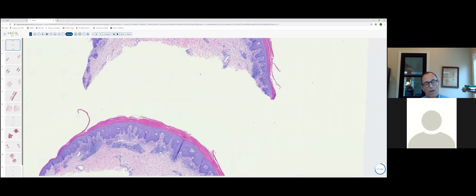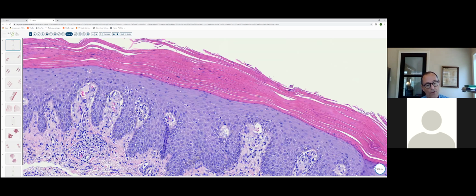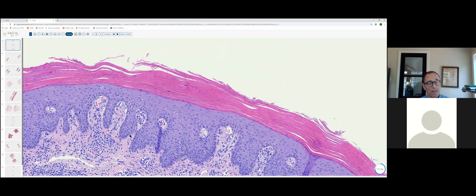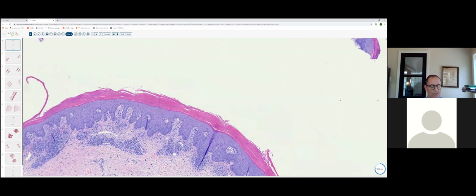As expected, beneath the confluent parakeratosis, the granular layer is markedly thin to absent. There are dilated and tortuous vessels evident within the papillary dermis, some closely approximating the undersurface of thinned suprapapillary plates. There are a few suprabasilar mitotic figures. Taken together, these findings are most suggestive of plaque-like psoriasis.